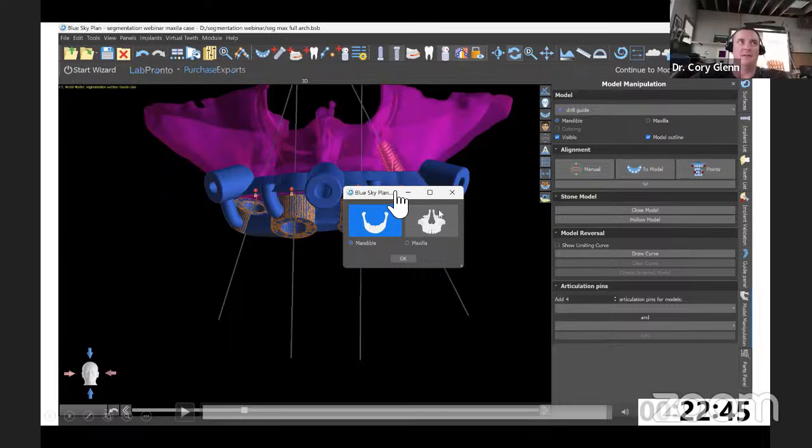The metal printers, at least Oral Arts metal printer, doesn't play nice with anything that's less than 0.5 millimeter in dimensions. So that's your bottom line. You can't make walls thinner than 0.5 millimeter, but down to 0.5 millimeter, it's extremely accurate. I'm not so sure it isn't more accurate than the resin printers, to be quite honest with you.